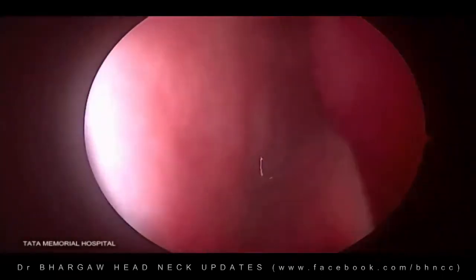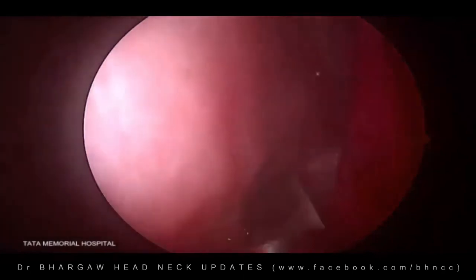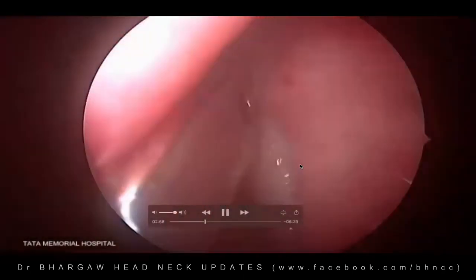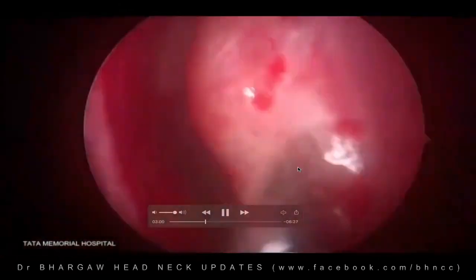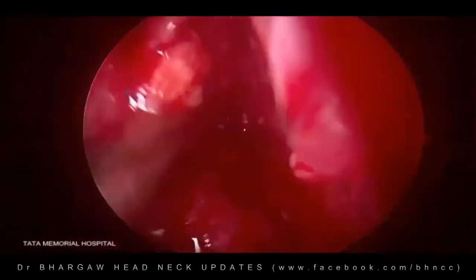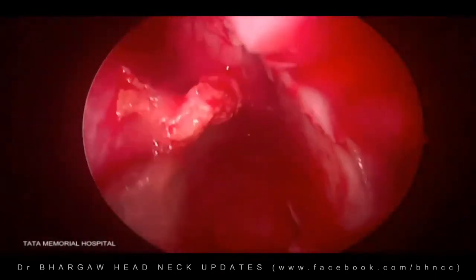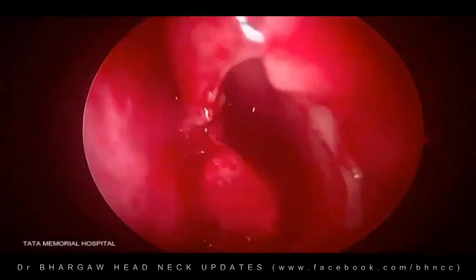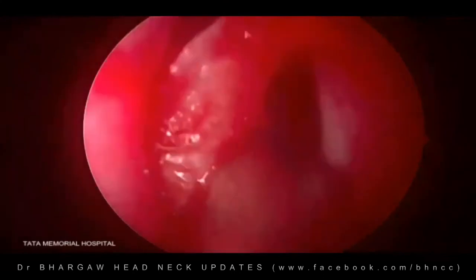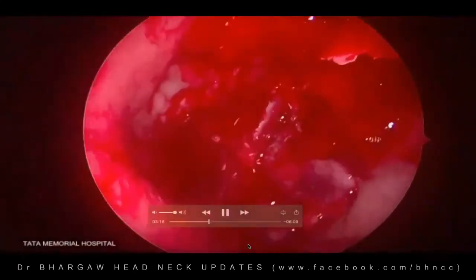So once that is done, we went ahead doing the ethmoidectomy on the opposite, the right side. That is the area where there was disease, and in this case, we did the septectomy in the beginning itself, so it could be done this way as well. We removed the septum and made way, because it was an S-shaped deviation. So we removed the entire septum on either side.